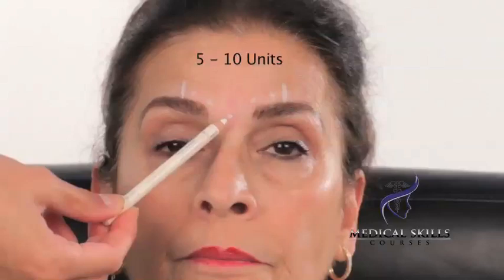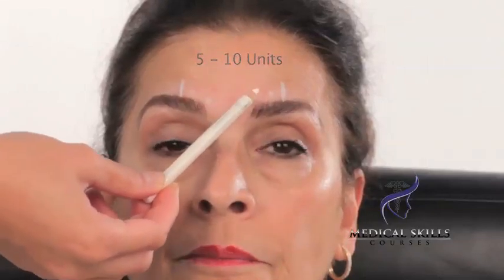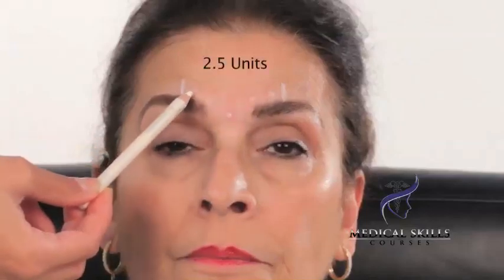In terms of the number of units to be injected into each of these points, it is at the clinician's discretion. However, the following guidelines should be taken into account: the first injection should be between five to ten units, the second and third should be five to ten units each, and each of the lateral two should be 2.5 units. In this particular case, given the muscle strength, I would put seven units at each of the three main points and 2.5 at each lateral point.